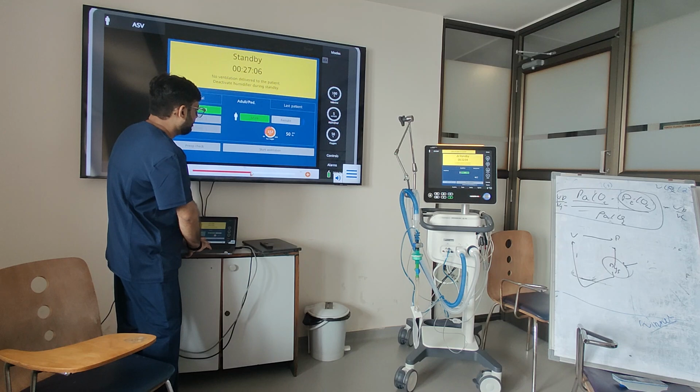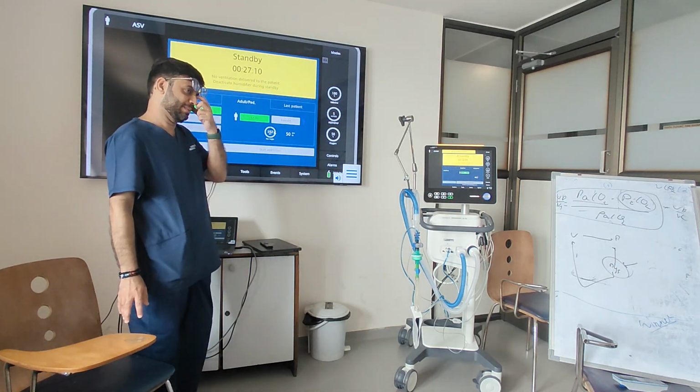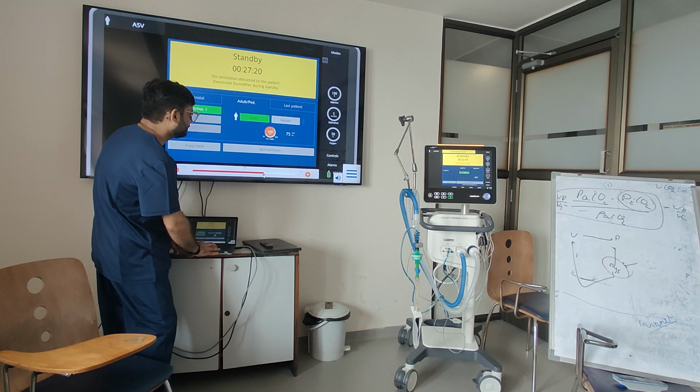152? Yes, it is coming, 50 kilos is coming. Calculation is exact, sir. I checked the calculation by chart. You understand, right? 50 plus 2.3 times the height in inches over 5 feet. You understand that, right?